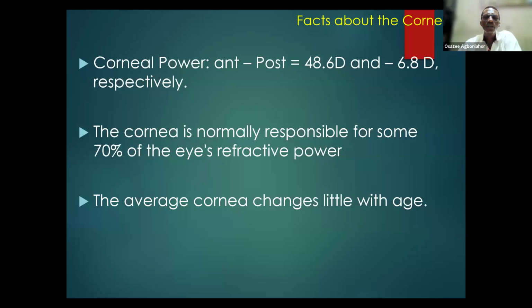Go ahead. So, studies actually show that there are some changes that occur as you grow older, as far as your cornea.